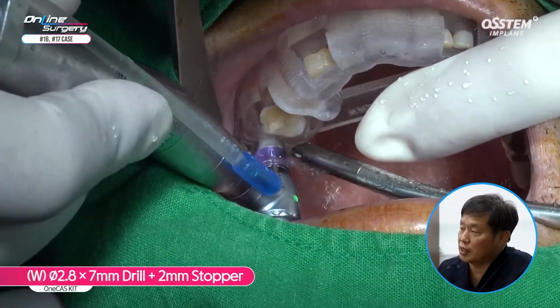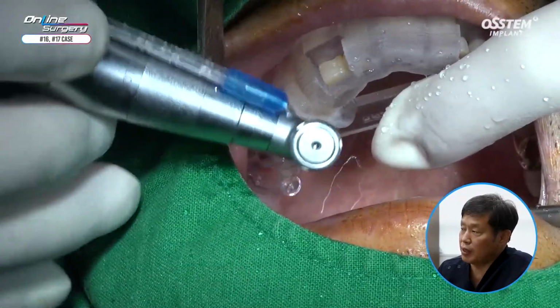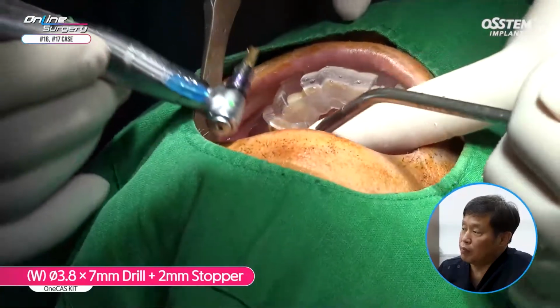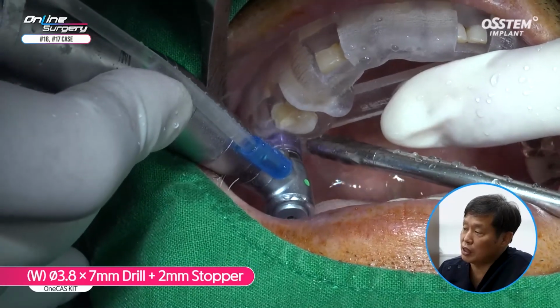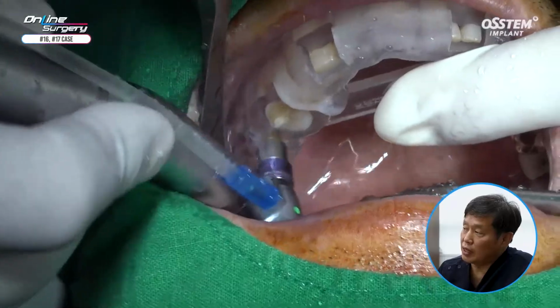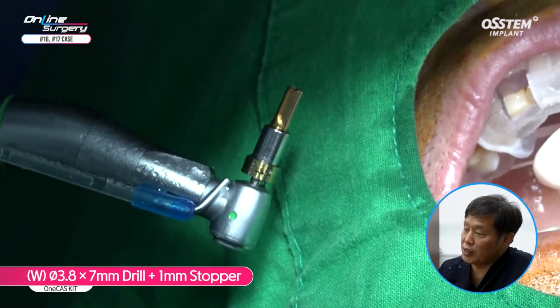The drill hole is expanded up to 5 millimeters. 3.8 by 7 millimeter drill with 2 millimeter stopper as mentioned. Because it is upper posterior, I assumed it was soft bone, and the final drill was the 3.8 drill. The sinus floor is not penetrated. 3.8 by 7 millimeter drill with 1 millimeter stopper.